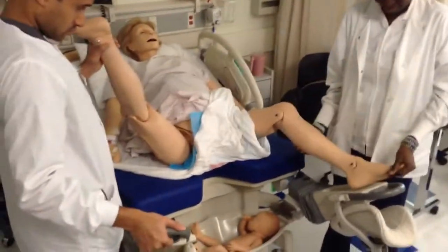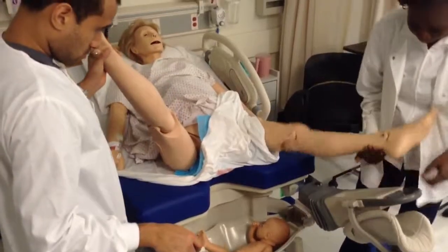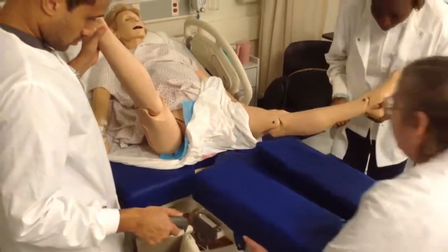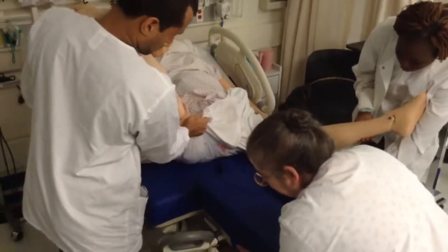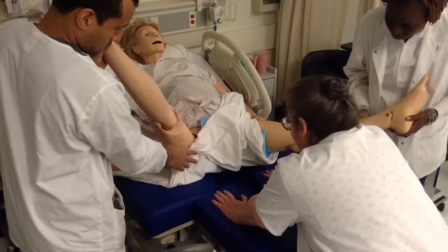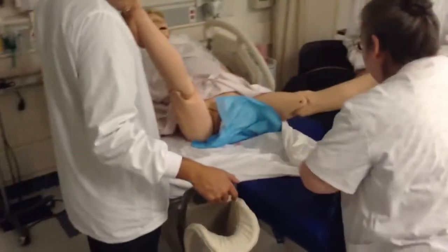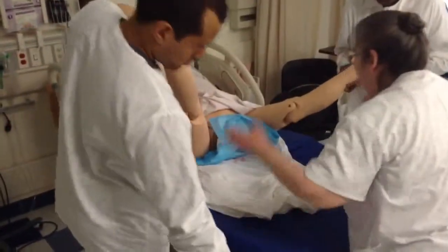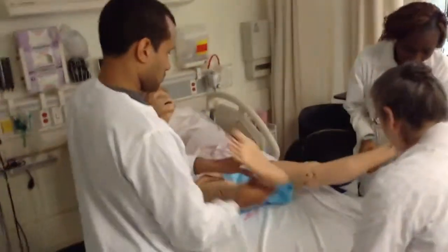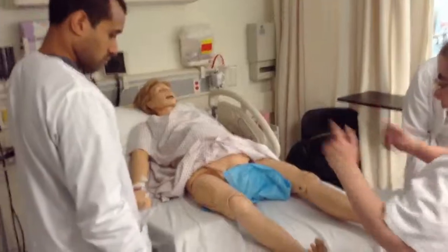Okay? When you go to put the bed back together, these two pieces go into the slots right there on the edge of the bed. Okay? And all you have to do is walk straight into the bed and make sure you're in the slots. And then the last thing you do before you put the patient's legs down, make sure you're actually in the slots. Then, when you do this with the patient, you want to put both legs down at one time. So, pull these down, put the legs down, then you put these down. Okay? Let's go down the back.